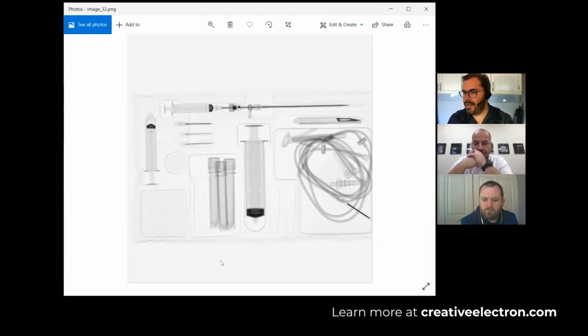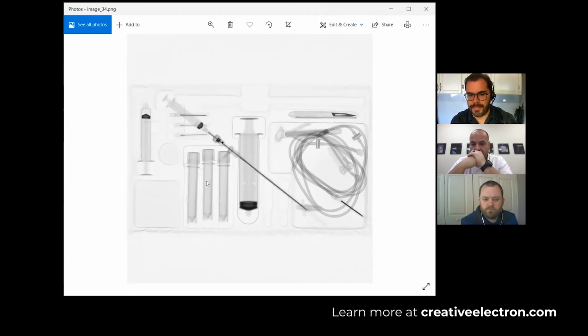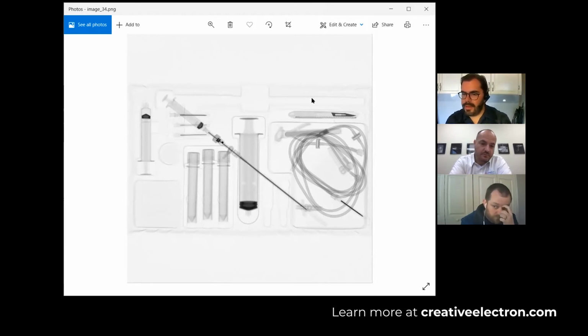We can locate the 3 vials there, and we can know their location, but does this merit a filled product? So, it can be complex. I can see the device here. This one moved, even though it's still a complete kit, they're kind of moving around. So that's where we work with a customer on what their requirement is.